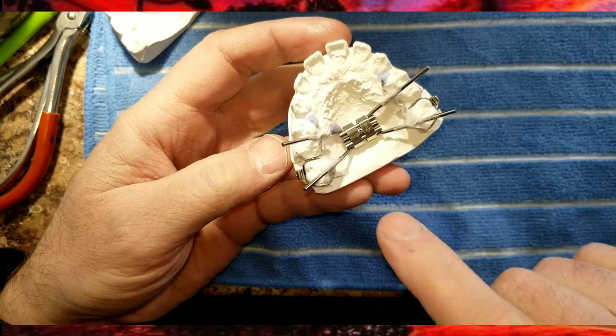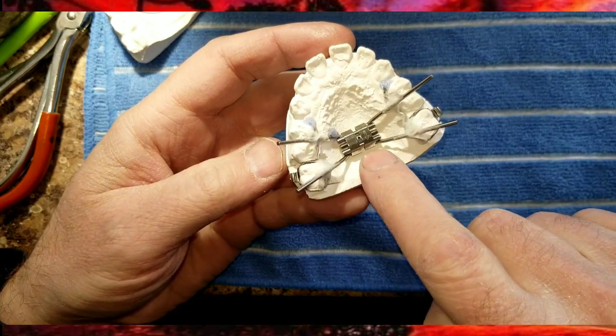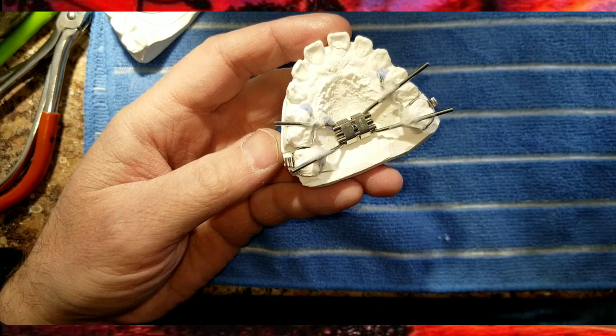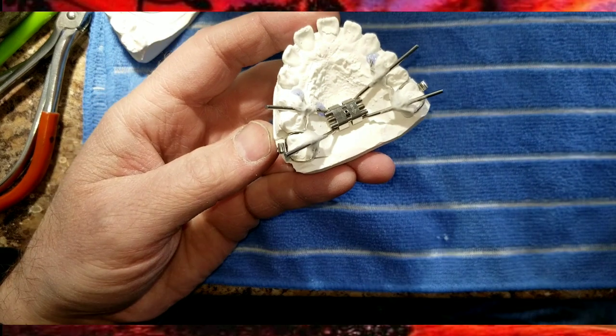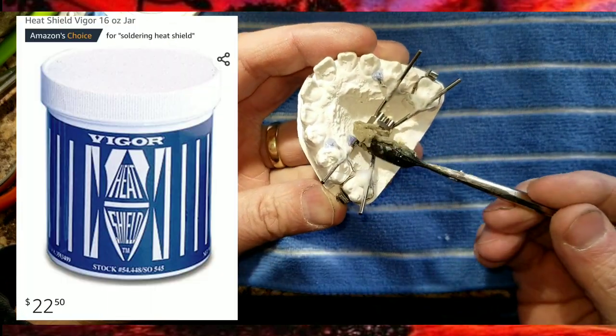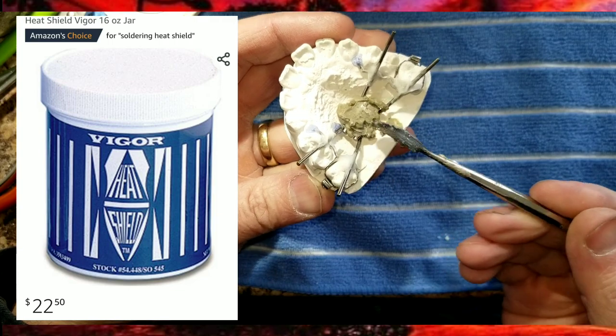Before soldering expander appliances, it's a good idea to lather up the expander to protect it. That's where you want to use your heat shield — it protects the spindles inside from melting when you're applying heat.